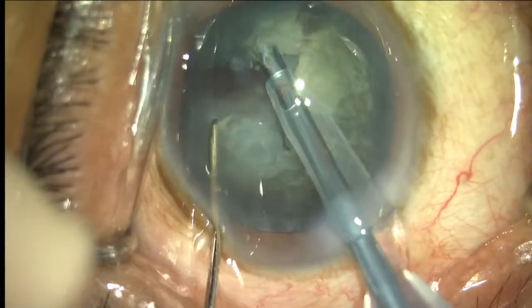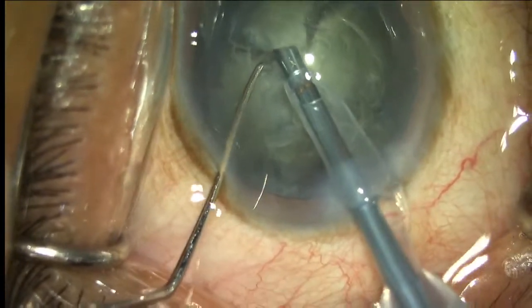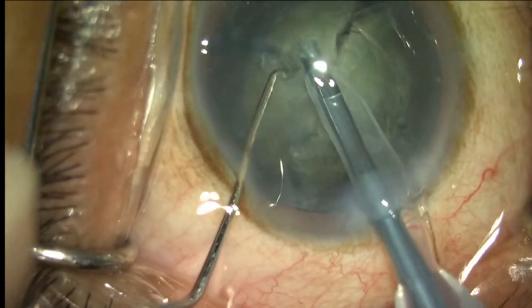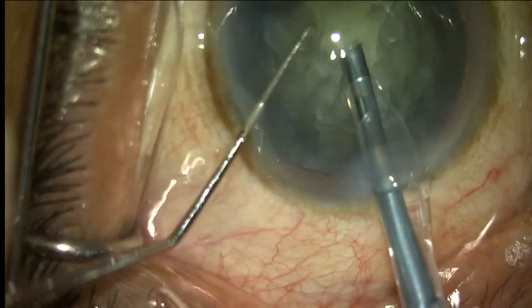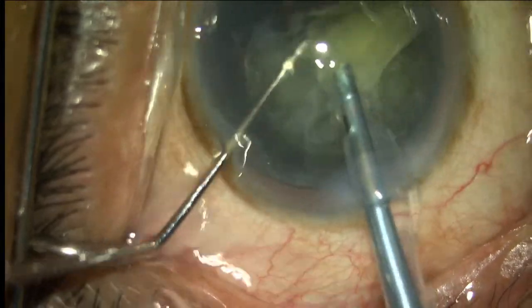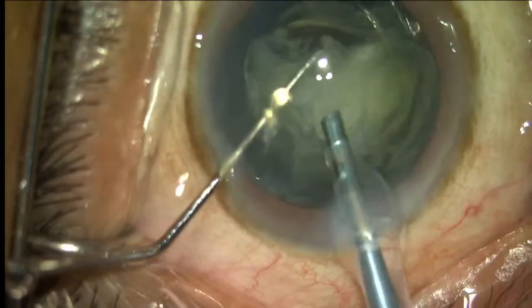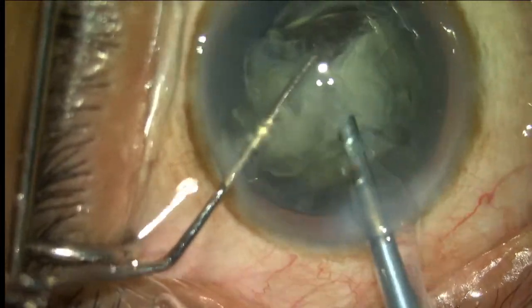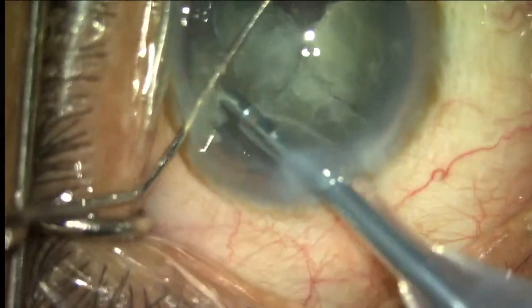So I'm done with my sub chop. Change the setting, please. Quadrant. In the quadrant mode, my vacuum is 570. Aspiration is 42. And power is 40. Power is 50, I believe, no? 40. Please change the power.